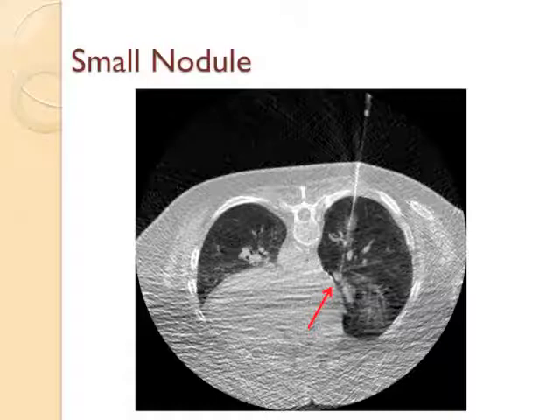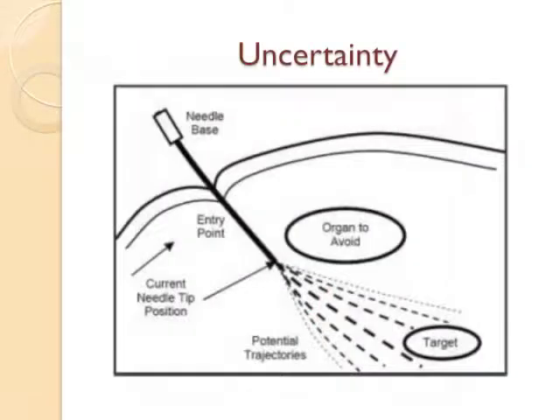And I put the needle all the way through right down here into the nodule to obtain a sample. And just to show you, there's lots of newer techniques that we're looking at with computers to help locate these nodules and to assist in getting the needle inside the nodule. It turns out that if you think about advancing a needle and you're trying to go to a target and the needle is here, you're never quite certain as you advance it whether it's going to go straight or whether it may curve a little bit one direction or the other.